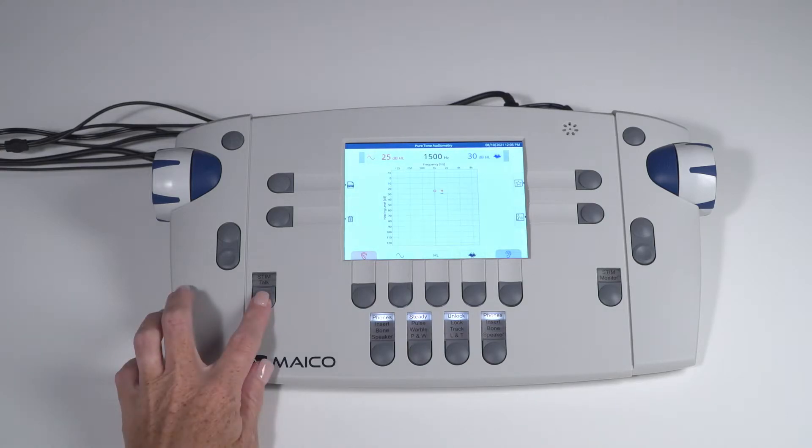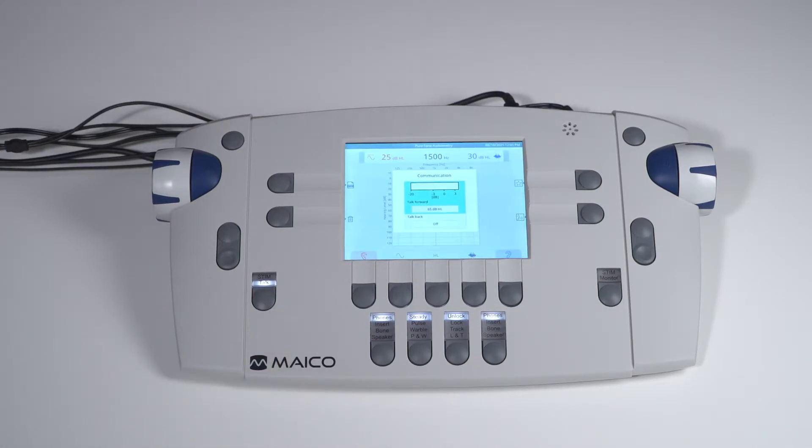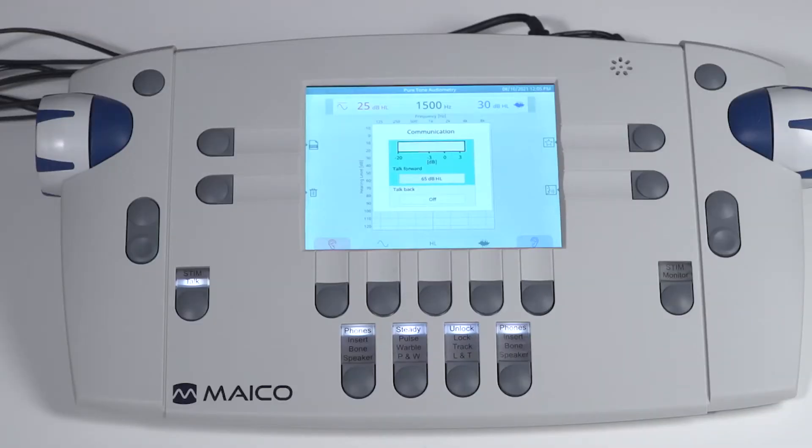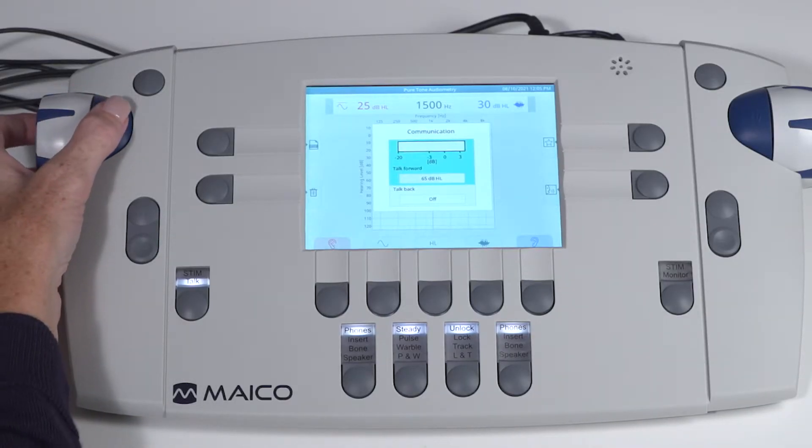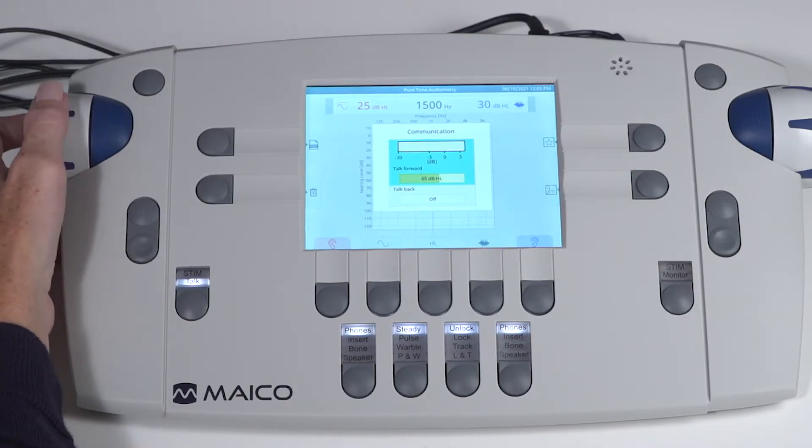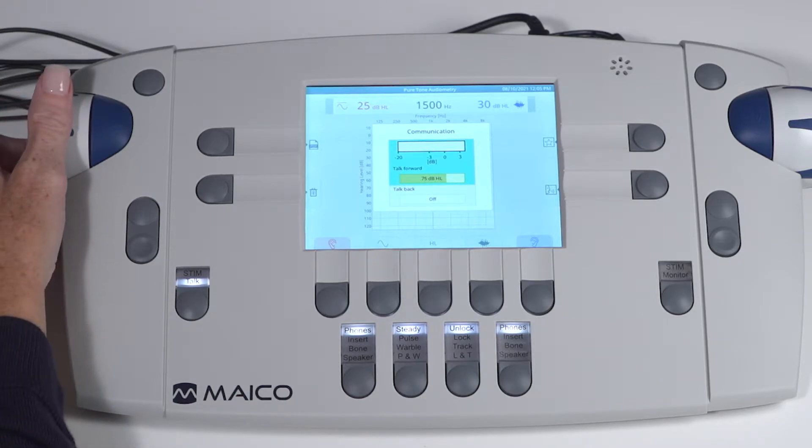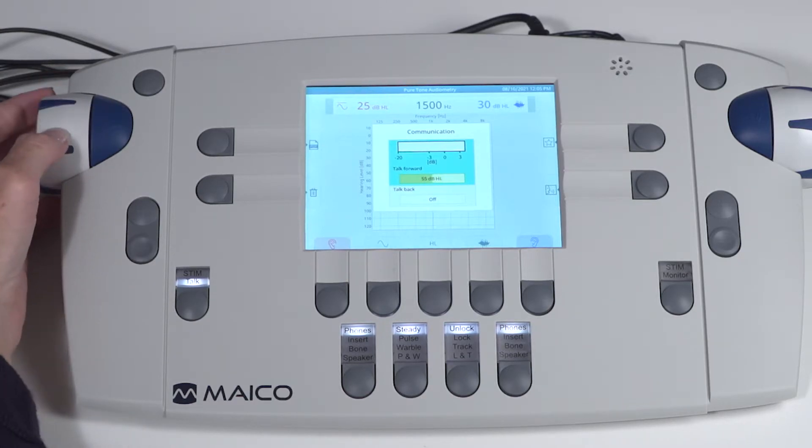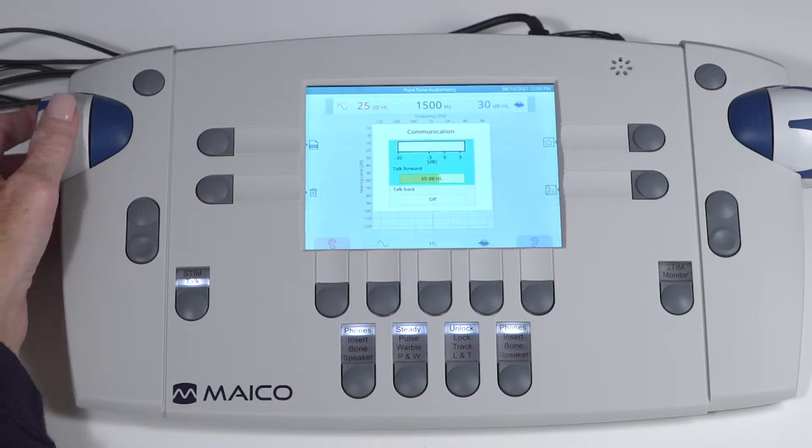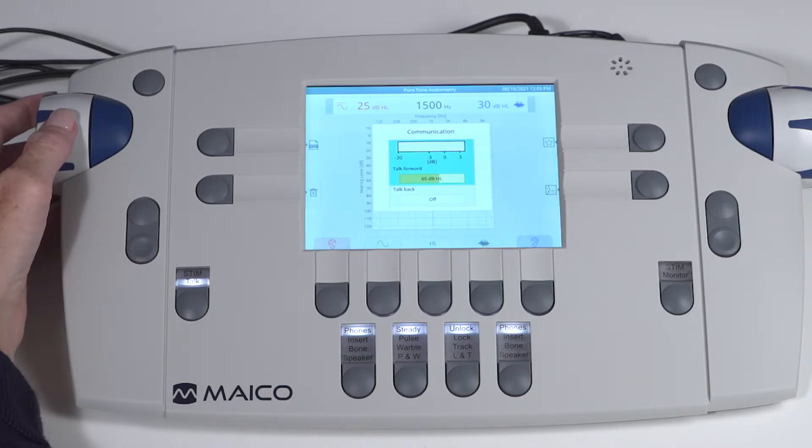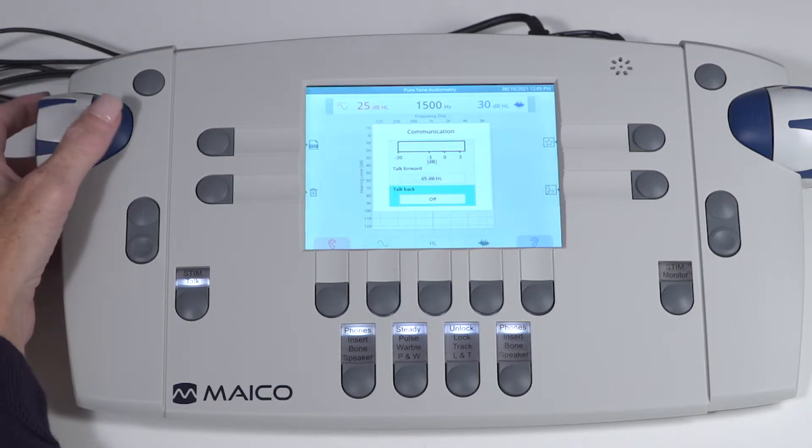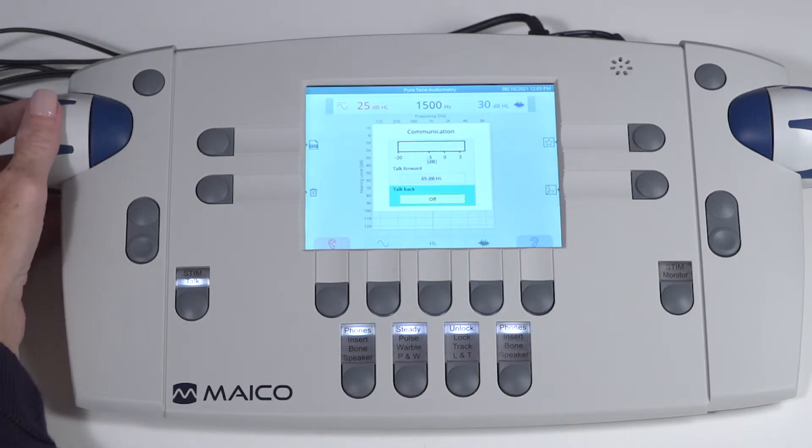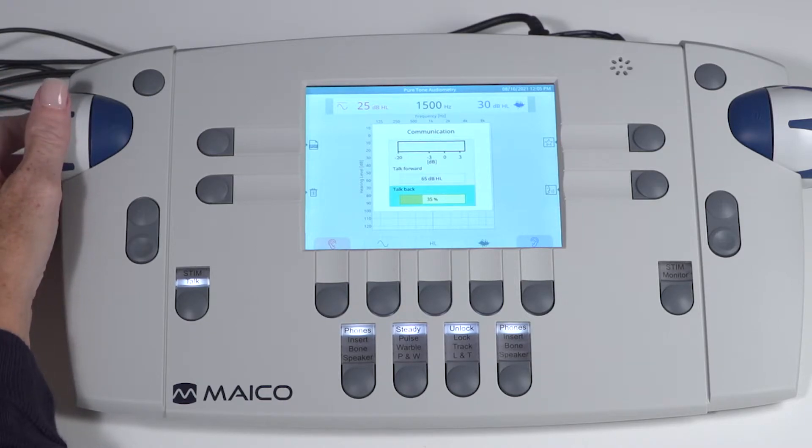The left stim talk key is also used to activate talk forward so the patient can hear the examiner. This button also allows adjustment of the talk forward volume and the talk back volume. Hold the key to activate these functions. Once activated, highlight which function to adjust, talk forward or talk back with the dial. Once highlighted, press the blue present button to activate your selection and the dial to adjust the level.